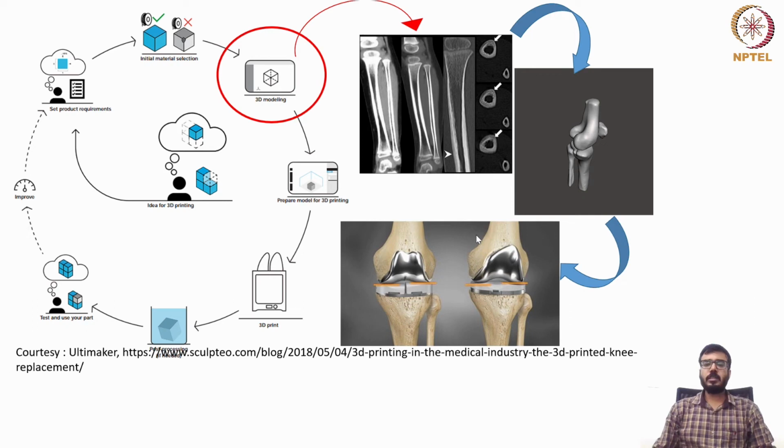So here we will discuss further how the first step, where we convert medical image data to a 3D model, works.